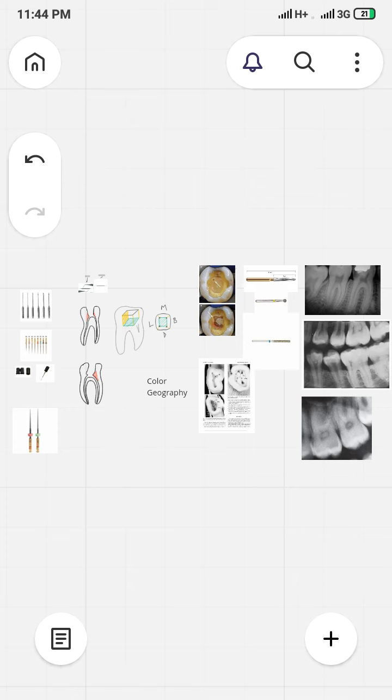Today we are going to talk about three important steps of root canal: deroofing, locating canals or exploring canals, and removing dentinal triangle. I chose to talk about these three steps because, speaking from my experience, most of the mistakes I have made during root canals, I have made in these three steps.